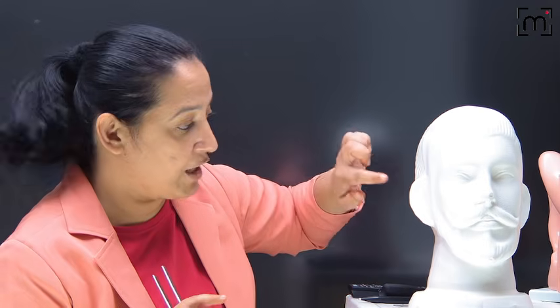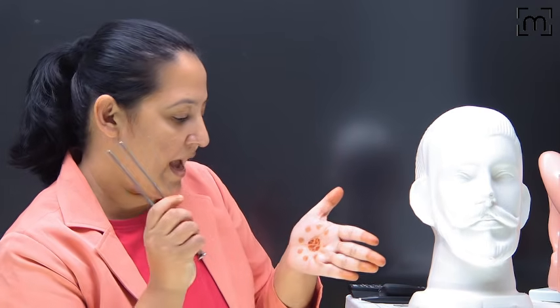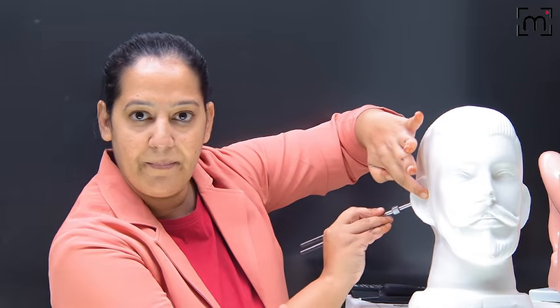But if we are doing it with the meatus occluded, I am activating the fork, occluding the meatus and keeping it here and noting the time. I am activating it, occluding my own meatus and keeping it here and noting the time. So this test is ABC. Here I have blocked the background noise in the patient as well as in me. Okay. So what is the interpretation?